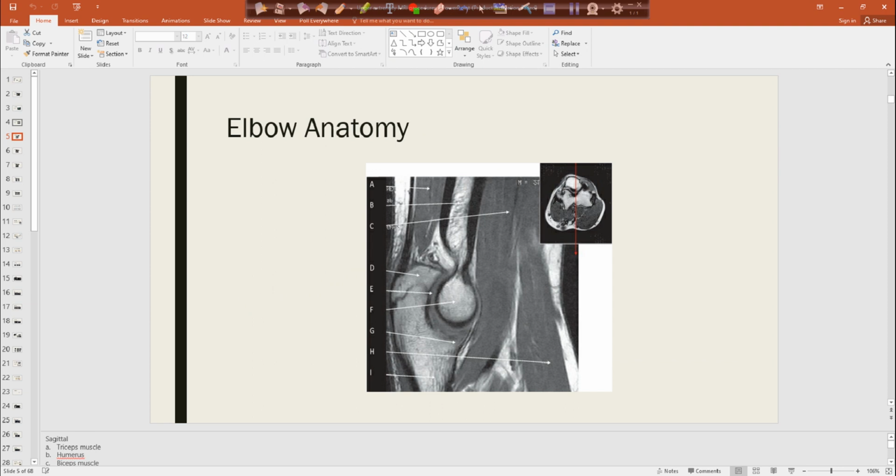More distal. So we've got our elbow. This is a sagittal here, and we have an axial that's based off of it. You can see the scan plane as you go through your axial. Do you guys see any pathology on this image? Fracture. Of what? The olecranon process.